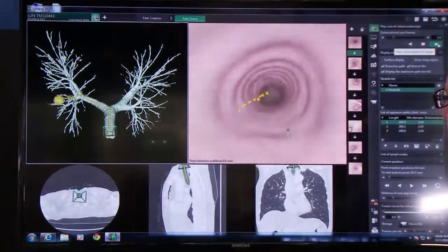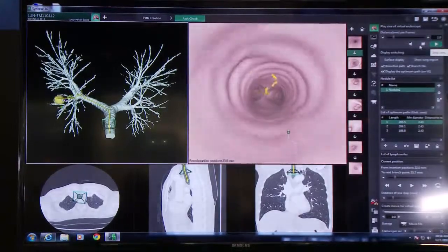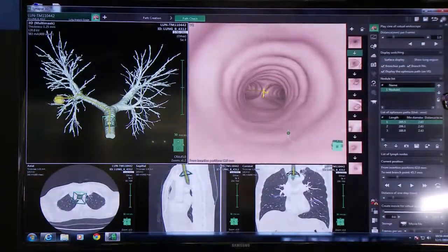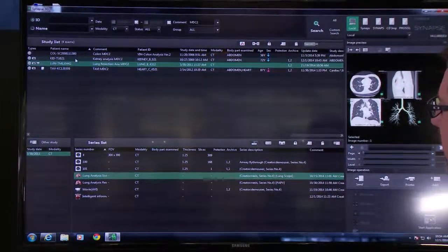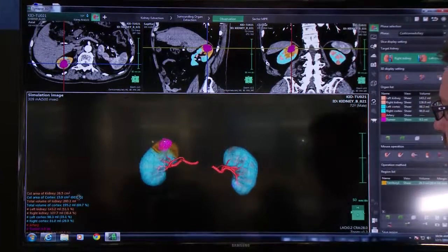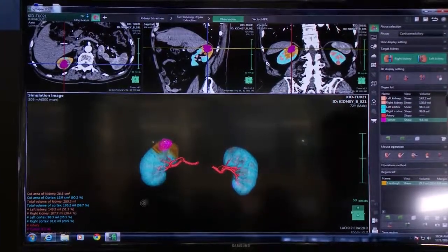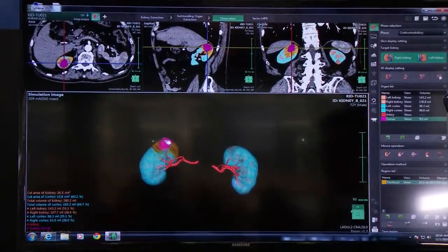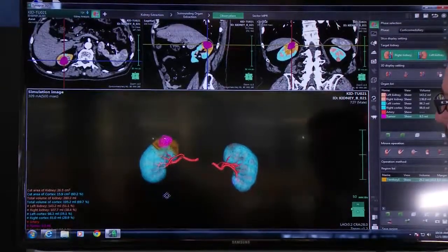This is good for pulmonology and for tracking these types of lung nodules. Another example of our tools in 4.1 is kidney analysis. In this particular view, we see all the volumes of the cortex — the volumes of the left kidney, the right kidney, the tumor itself, along with the territory that the vasculature is feeding of the tumor. Thanks, Mike.